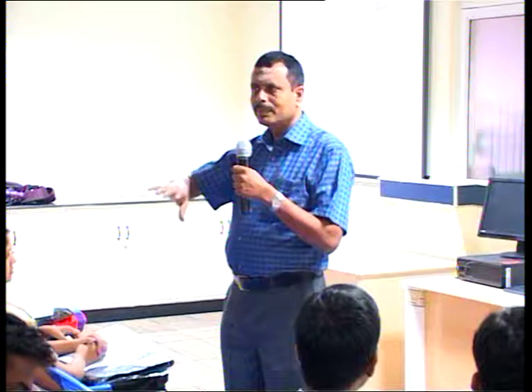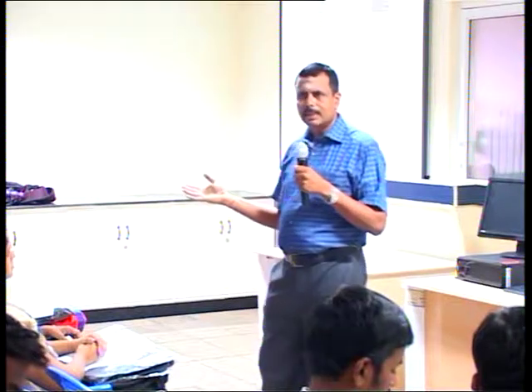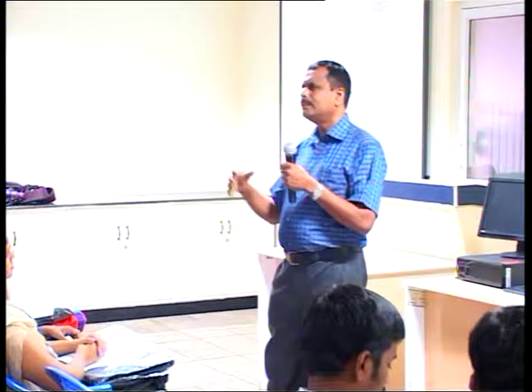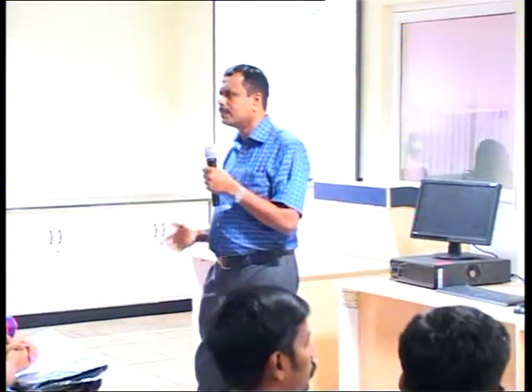It's not the machine in problem, it's the patient side problem or the machine side problem. I think we should be able to diagnose. Am I right? That's the reason why we are all together, so that we can see the patient side problem also, from the interface of the biomedical equipment, which we want to bring into the curriculum in the biomedical college.